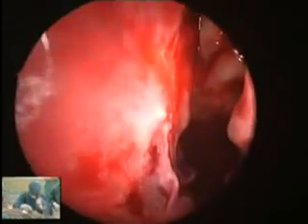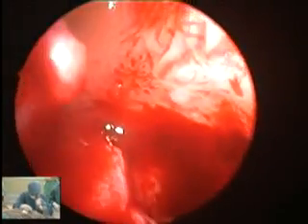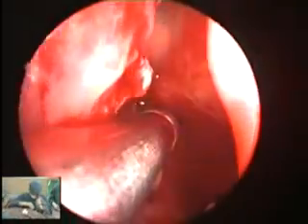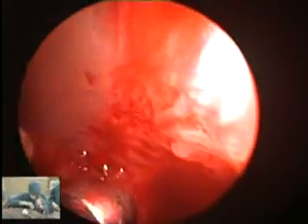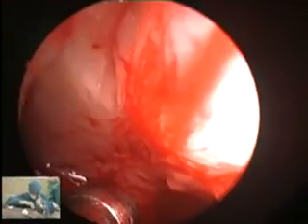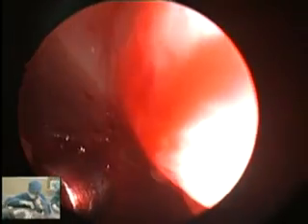I would definitely remove all fungal material, if possible. I would not leave any behind. So I may have to adopt other approaches during the operation. Curve suction. I think it's very important to remove all the fungal material from the sinus. If you leave fungal material behind, the chances of the fungus recurring are very, very good, and you will find that the disease returns within 3 or 4 weeks of the operation. So you really need to make sure that all the fungal material has been removed from the sinuses.